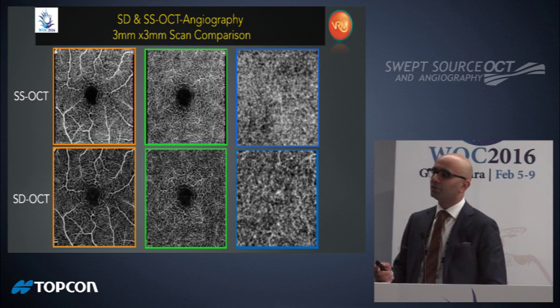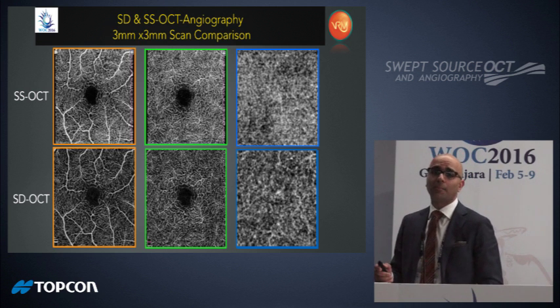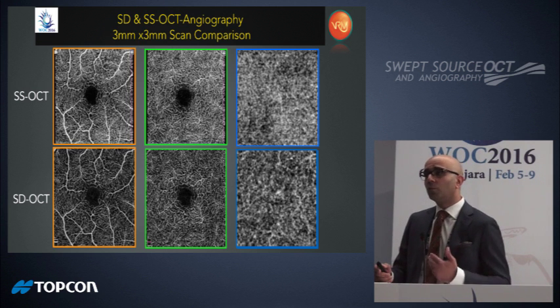One other element that those of us that are using this device may also be seeing is that the images from the spectral domain in the choroid capillaris seem a little bit dimmer. Now, whether that's in fact a function of post-processing that occurs with swept source versus spectral domain, that remains to be seen. But would it make sense?